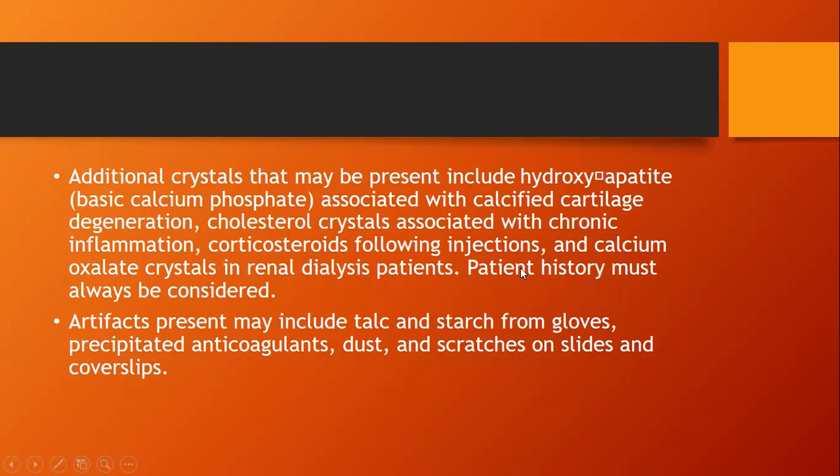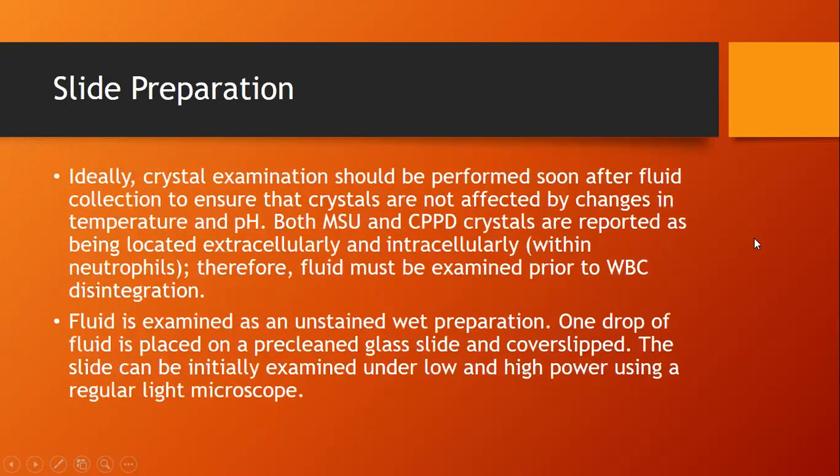That's why when doing synovial fluid analysis, we should have a background knowledge of the medical history of the patient. Now, artifacts may include talc and starch from gloves or precipitated, particularly powdered, anticoagulants. Also dust, and scratches on the slides and cover slips.